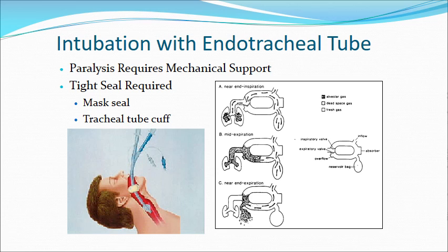So some of the most serious forms of respiratory impairment, such as ARDS, which is Acute Respiratory Distress Syndrome, which is one of the outcomes of COVID-19 infection, require very drastic measures to ensure that an unconscious and in fact paralyzed patient can receive breaths directly under the control of the ventilator.